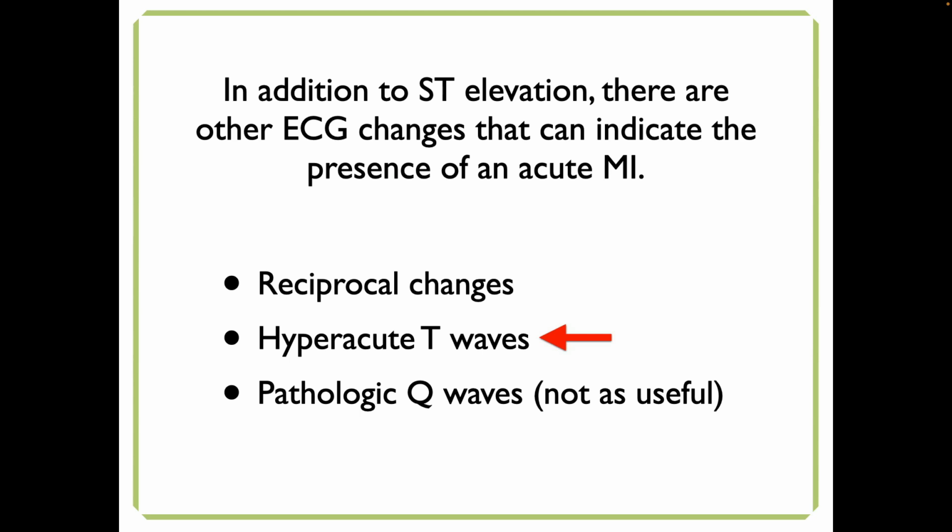Hyperacute, what does that mean? Okay, well the hyper, everybody always knows what that is. It's big. So do you think this means extra big T waves? Big, small. Wrong. What does acute mean? Quick. Like, an acute problem is something that's happening now.